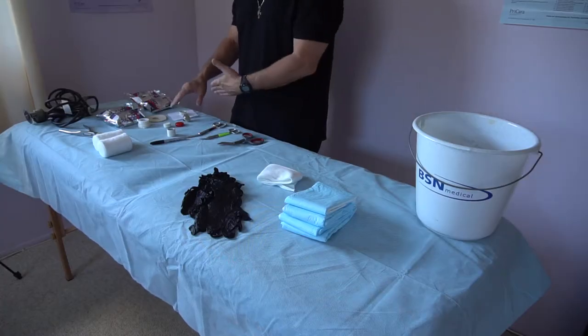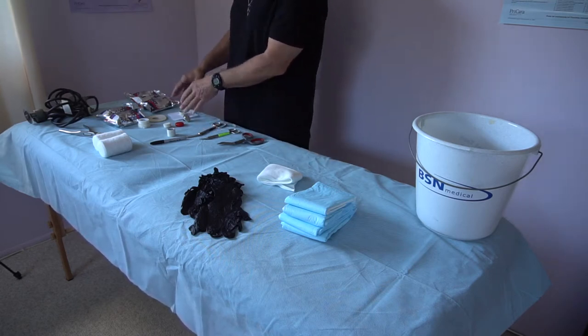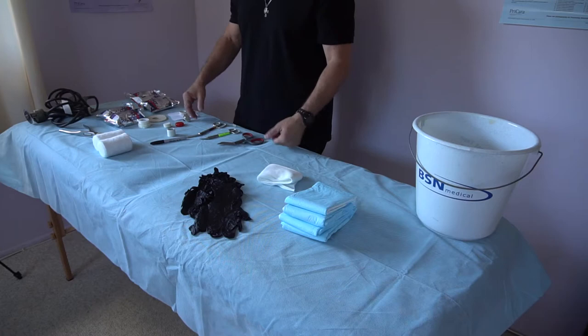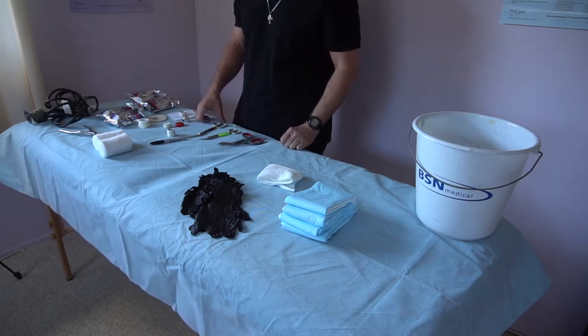So wrapping one layer, taking the time to mark, cut, window, put the bone stem in, then the second layer — sometimes works well, sometimes doesn't. So we've come up with this technique and I'm going to share it with you.